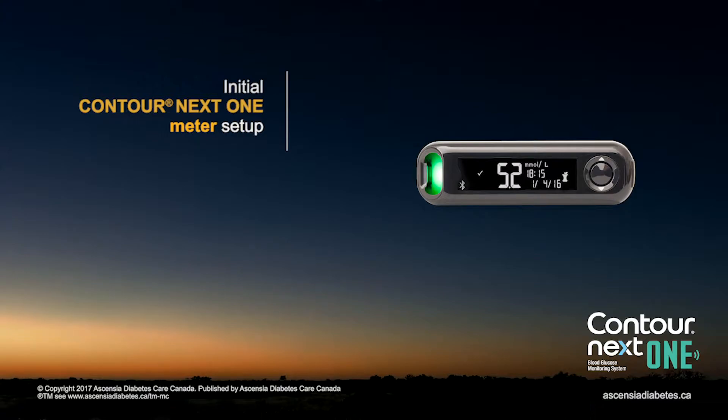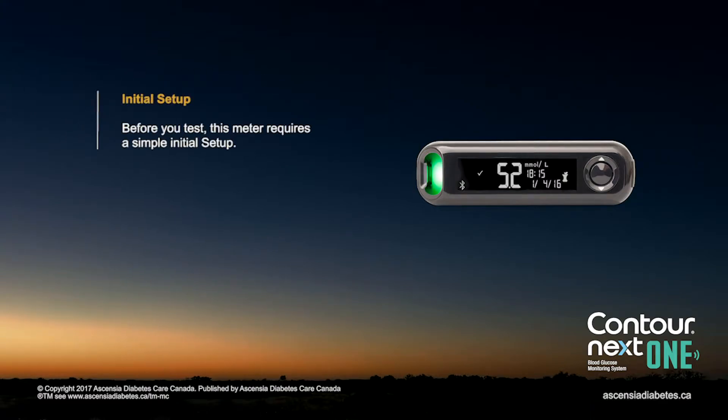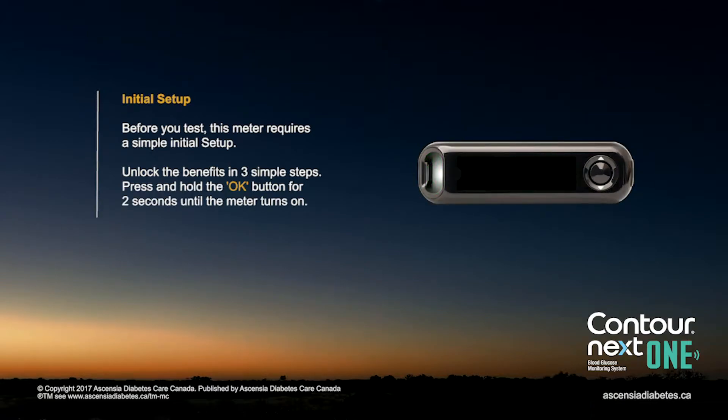Initial Contour Next One Meter Setup. Before you test, this meter requires a simple initial setup. Unlock the benefits in three simple steps.